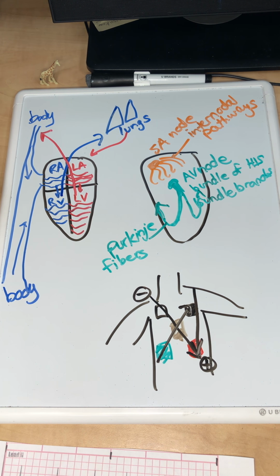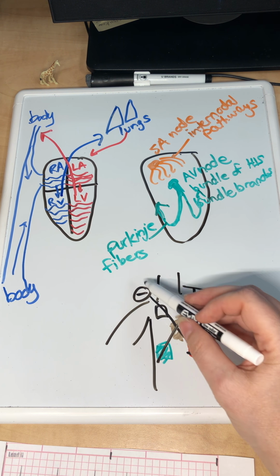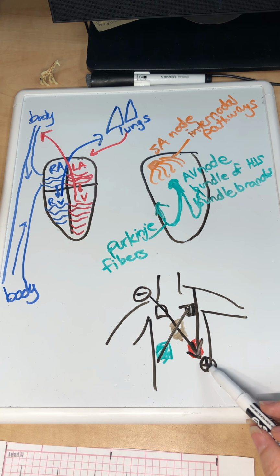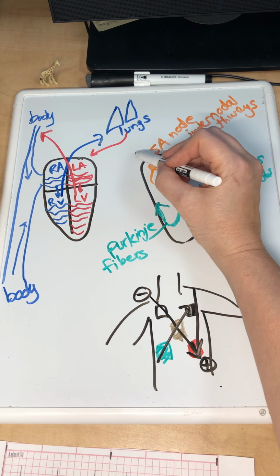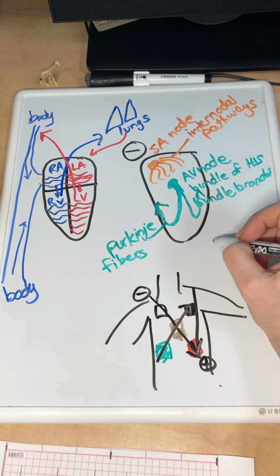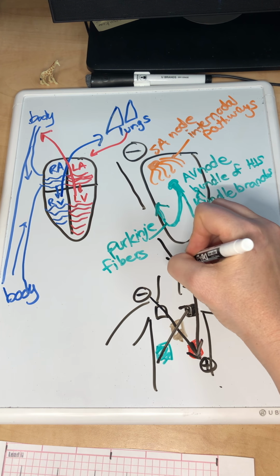For instance, maybe there's not enough oxygen getting to the heart. And so where is that taking place? You can tell by looking at it from lots of different angles and seeing where the problem is in the heart. But for our purposes, we're going to focus on lead 2, which is reading the electricity from a negative pole up in this corner down to a positive pole in this lower left-hand corner. So we have a negative and a positive down here, and we're reading in this direction, okay?